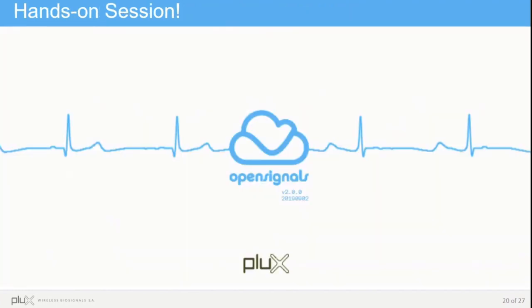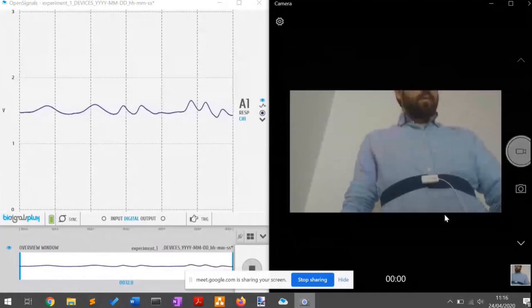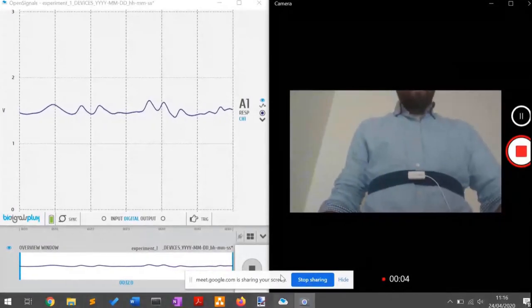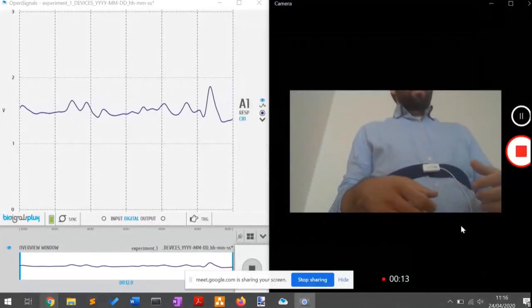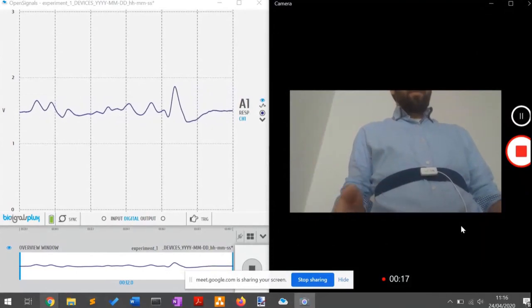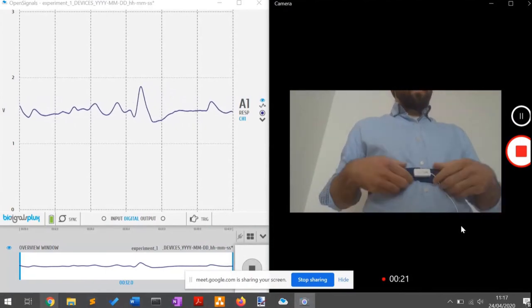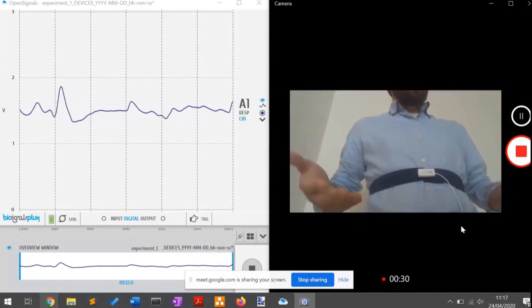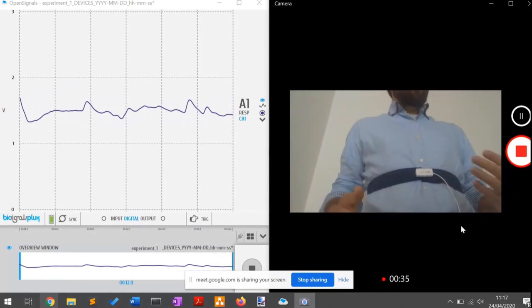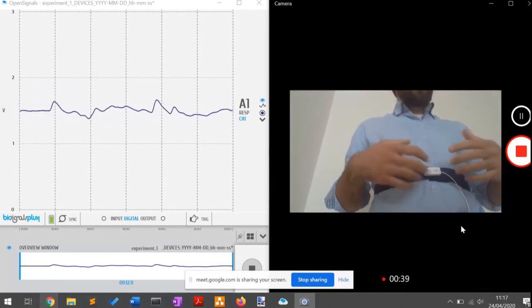Pedro will continue now with the hands-on session and show some examples in real time. I'm going to share the screen. What I would like to show you is how the sensor behaves in a real-time acquisition. One of the things we have already explained is the positioning. I've positioned it on the lower part of the ribcage, because this is where we get the best signal. I'm going to demonstrate it right now by doing some deep breathing.